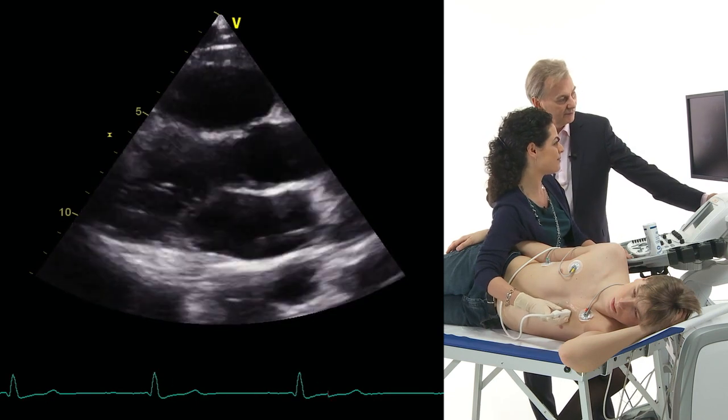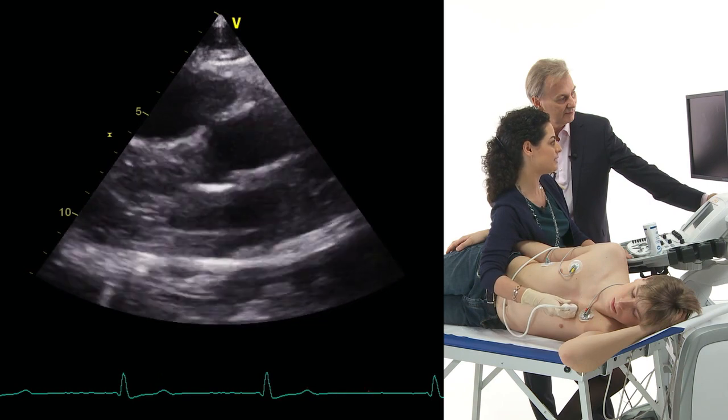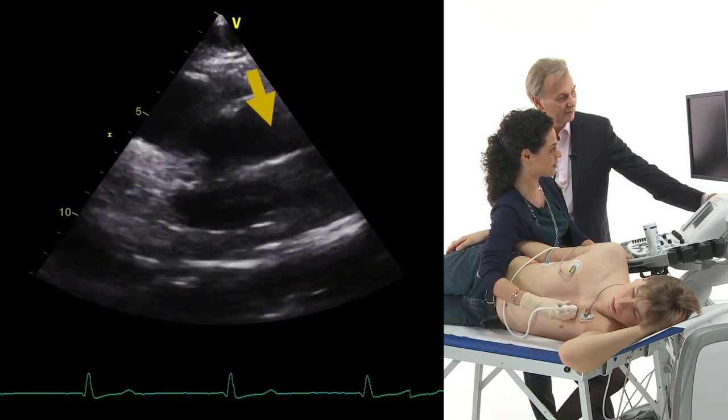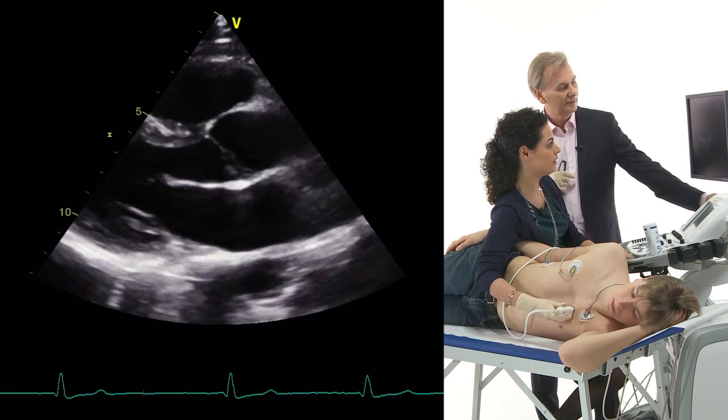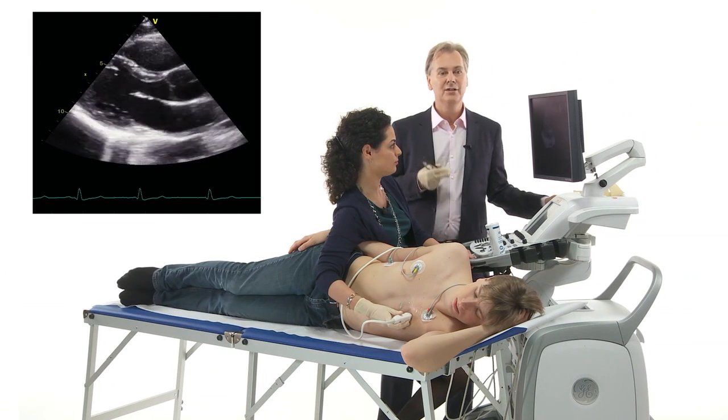Yes, exactly. This is a perfect view to visualize also the aortic root together with the ascending aorta. And this is extremely important to have a full picture of the two. Yeah, it's an important structure because there you will see a number of different pathologies, and you will also learn that the aortic valve is very closely connected to the ascending aorta.